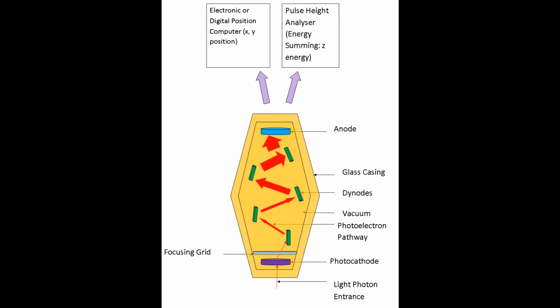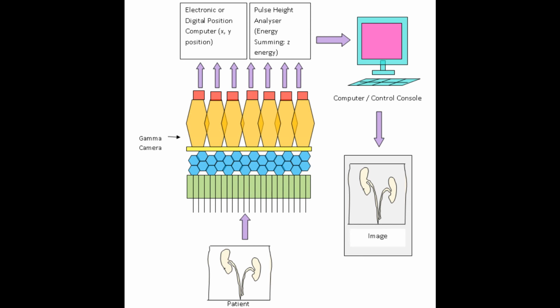The more modern gamma cameras operate through an analog to digital converter system, ADC system. This means that the PM tube output is directly digitalized through the system. These ADC systems are able to extract the position and energy data simultaneously. This approach improves errors caused by noise, pulse distortion, and pulse pileup. The final step to the image acquisition process comes once the images are generated on a computer monitor, where they can be constructed, altered, and generated.